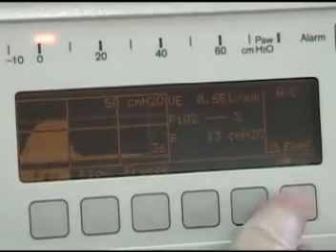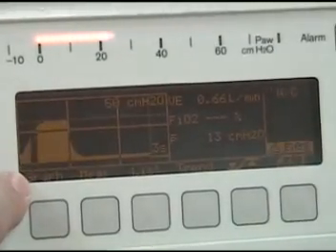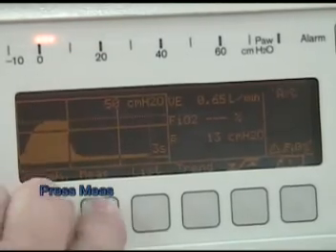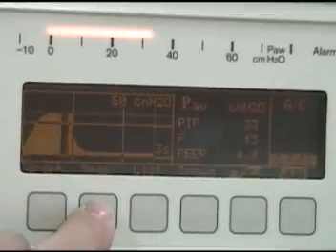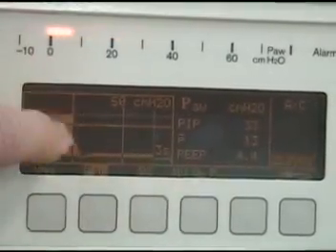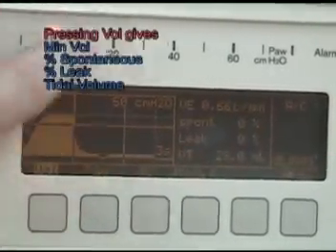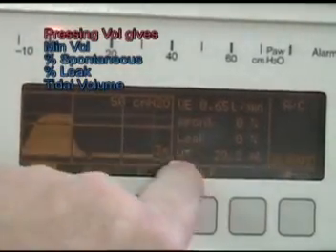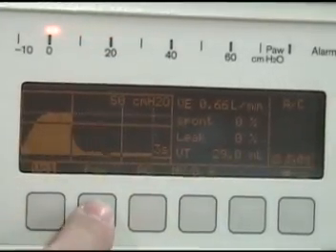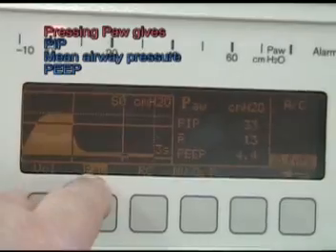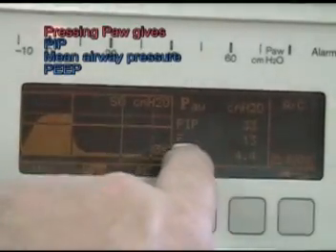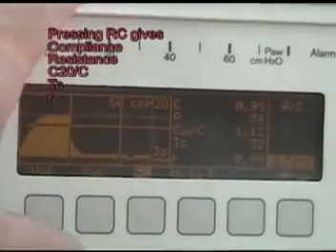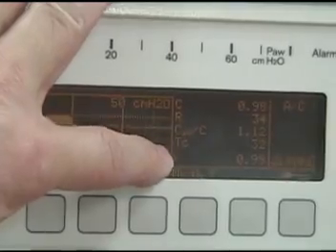Let's go back. We looked at graphics — now we can look at the measured by pressing the Mez button. In the measured, we can get the volume. Pressing this will give us our volume measurements: minute volume, spontaneous volumes, leak, and tidal volume. Press it here, we get our pressure, airway pressures — PAW, PIP, and PEEP, etc. And then we have our compliance and resistance and those factors.